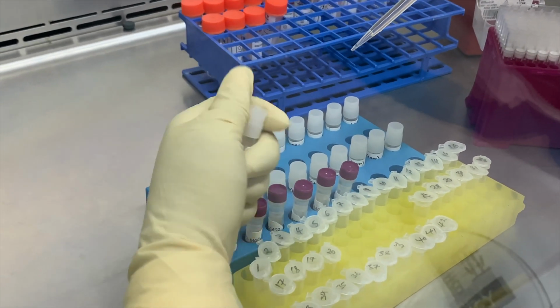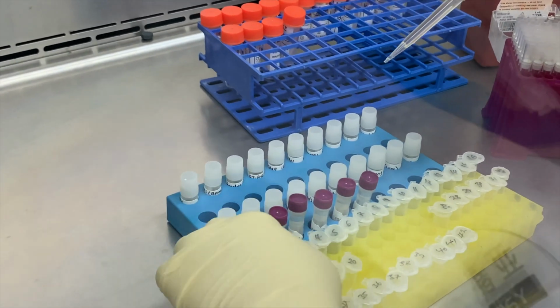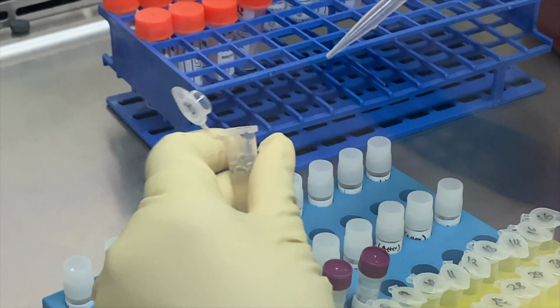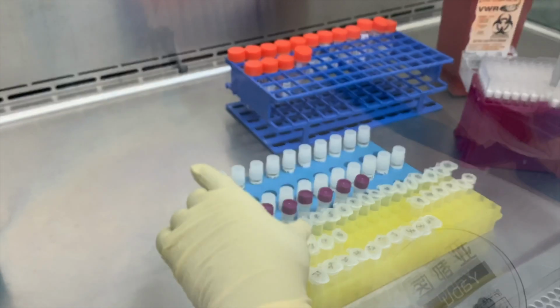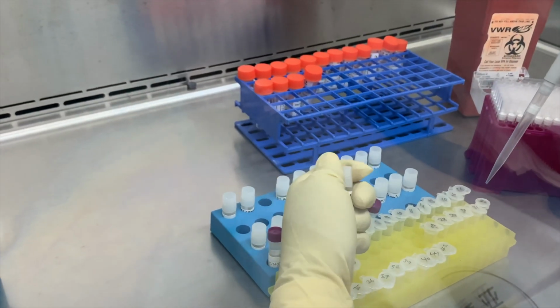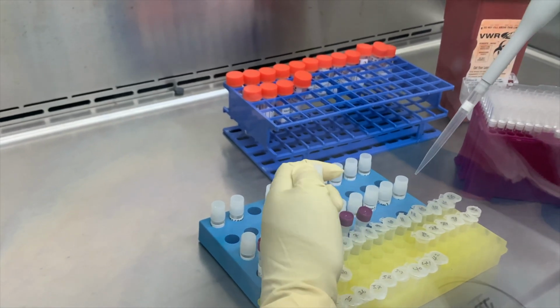You don't want this to spill on you, so you seal it very well and put it aside. Then we transfer it into this, called an Eppendorf tube, and that is where the downstream analysis begins.